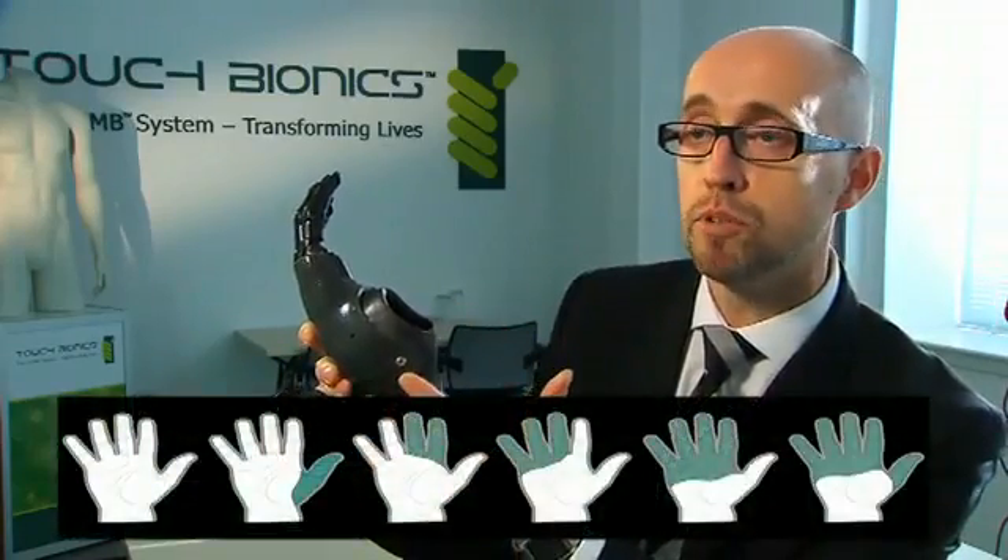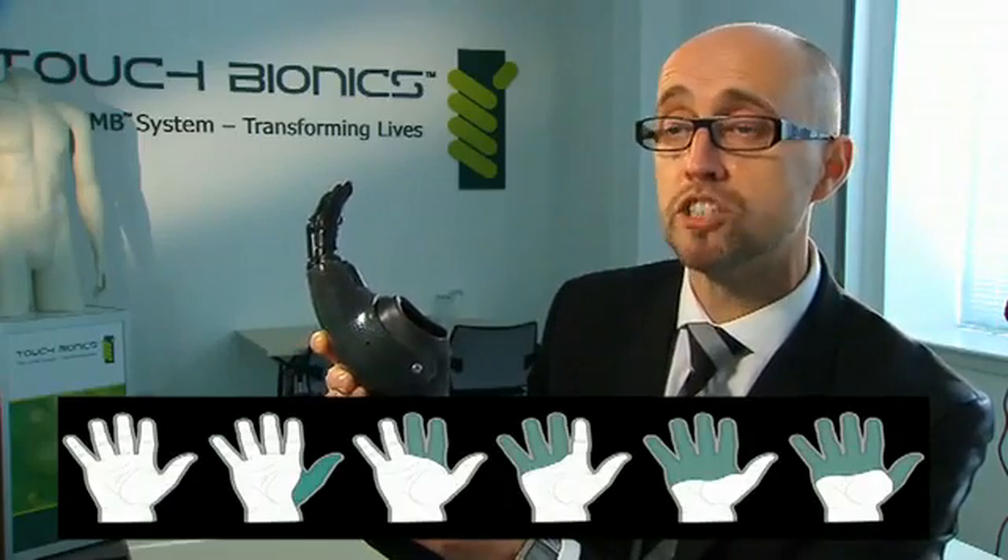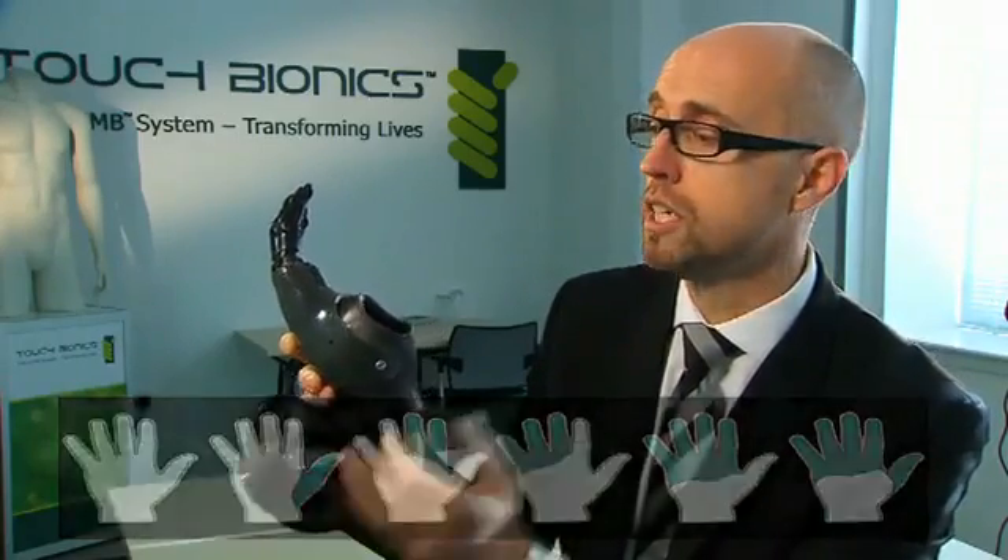If somebody has remnant fingers or remnant muscle, we need to make sure that we benefit from that in terms of providing the control and function. So in this particular instance, the thumb comes through the side of the prosthesis and then acts in opposition against the power fingers.